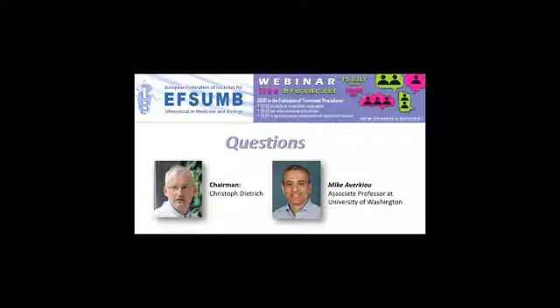It looks like if somebody looks at the literature today, the organ that's being quantified the most is the liver. Looking at my slides now, I realize I only presented about the liver, and the same techniques apply to other organs as well. The liver has the peculiarity that it has 2 inputs and 1 output, which complicates things a little bit. But nevertheless, we are able to do the liver because it's an easy target, a highly vascular organ, and it's easy to see the lesions and to do these techniques.